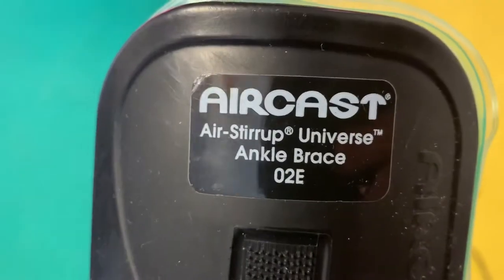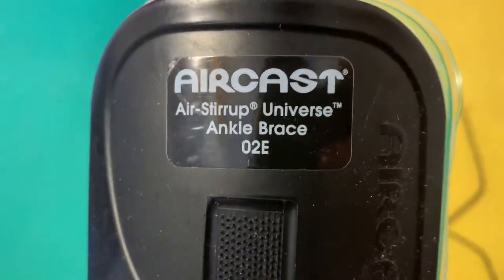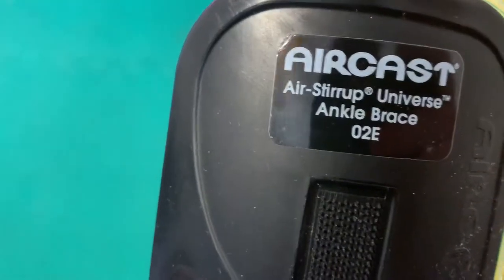Now this is the exact kind that I have. It's Aircast Air Stirrup Universe ankle brace, O2E — or 0-2E maybe, I don't know. And you need to know how to put this on if you ever injure your ankle.